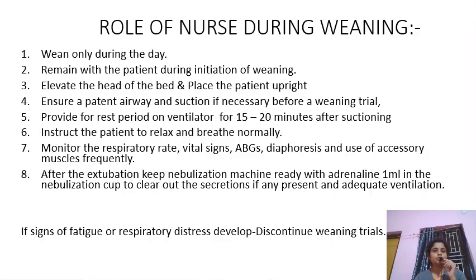Then the role of the nurse during weaning. Always wean during the day, not at night, because at night the patients are drowsy, so it should not be done. Remain with the patient during initiation of weaning and elevate the head end of the bed, and the patient should be upright during the weaning or after weaning when extubation is going to be there. During extubation also ensure patent airway and suctioning should be done.